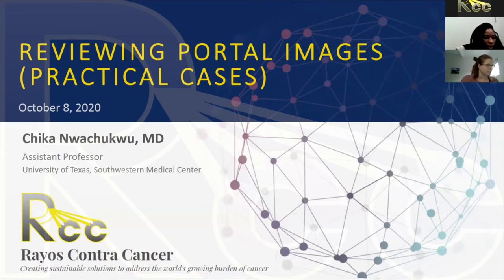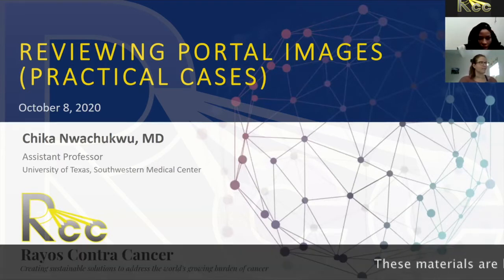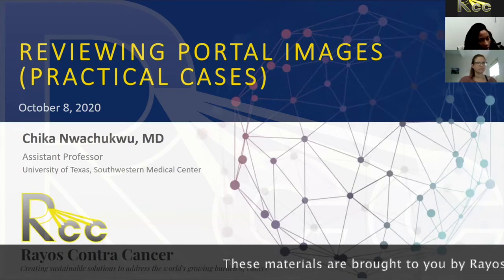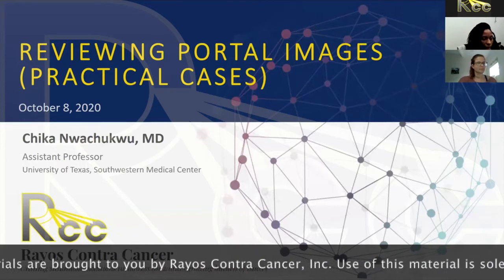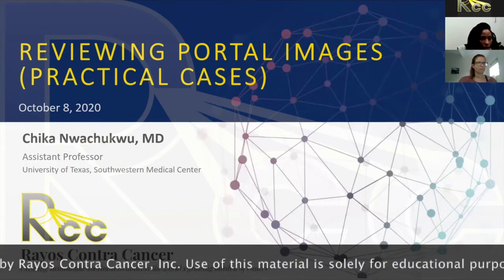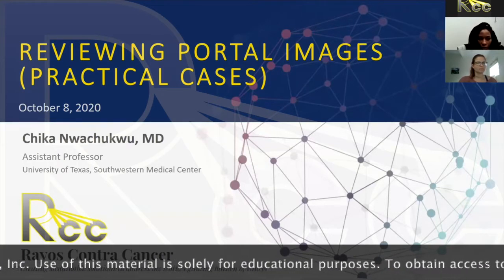Great, thanks Tia. Thanks everyone for joining. As Tia mentioned, my name is Chika Nwachukwu. I'm an assistant professor at UT Southwestern. I see GYN and breast patients. Today I'm just going to go over basics of reviewing a portal image.